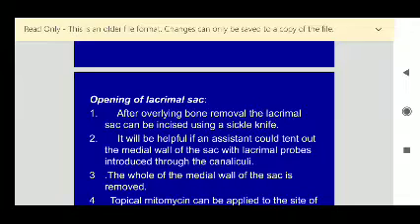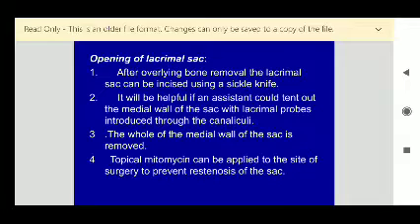The shadow of the lacrimal sac is visualized, and bone removal is done with a Kerrison punch, 2 mm or 3 mm, or with a long shank endo drill with a cutting burr, till above the axilla of the middle turbinate.